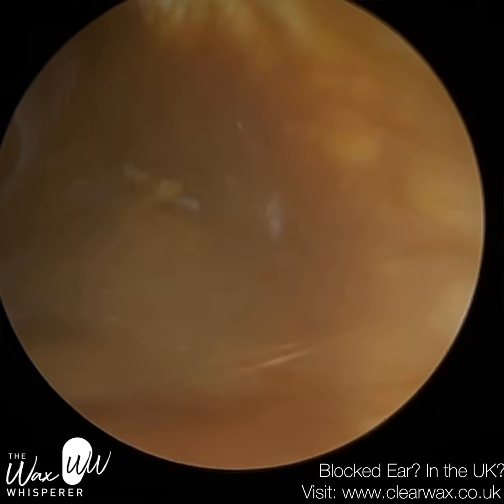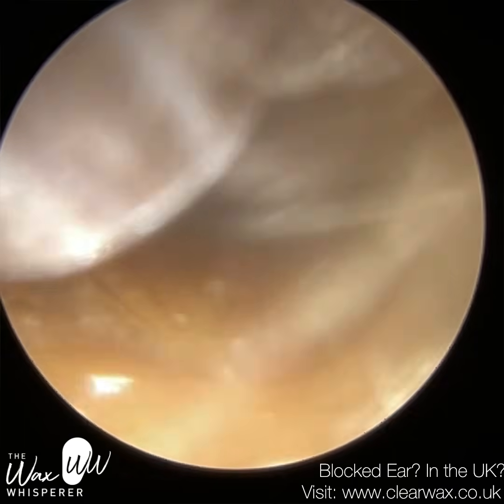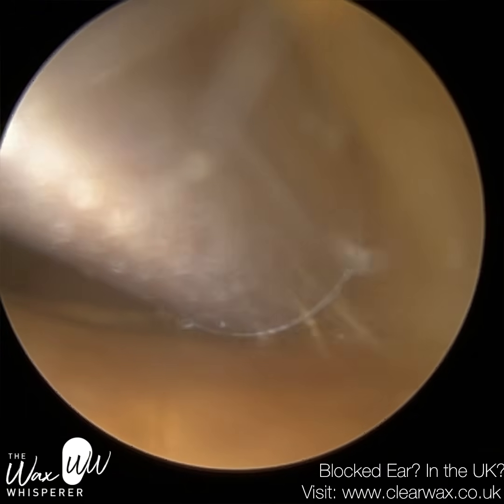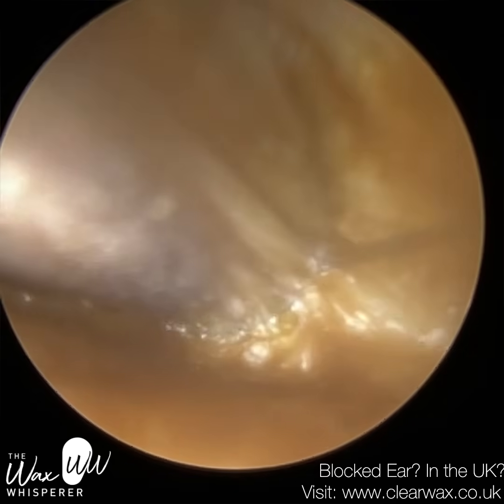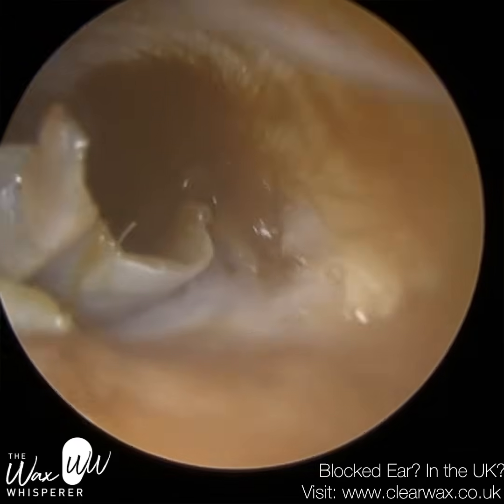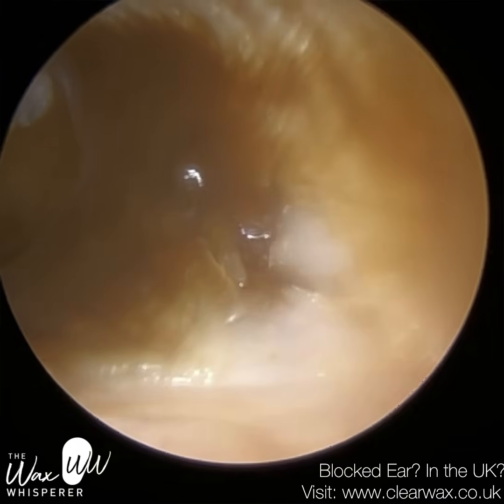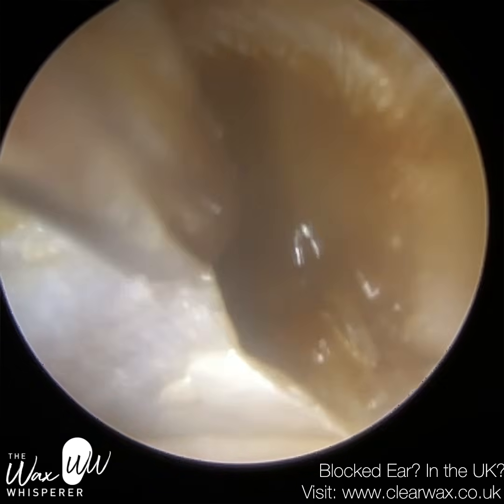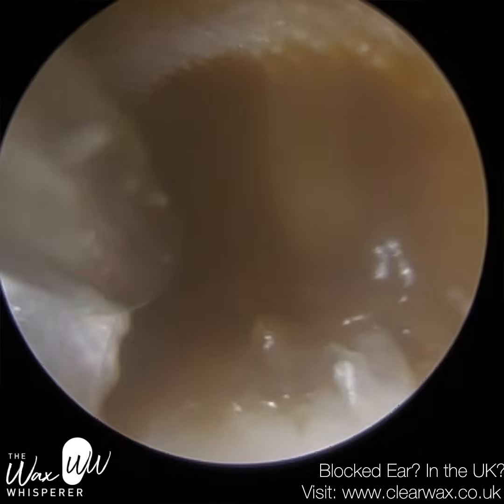We have here a patient who attended with a blocked left ear, and upon examination we can see that this patient is suffering from a condition called otitis externa. Otitis externa is an umbrella term given to an infection or inflammation of the outer ear. Now, more specifically, this patient has got eczema of the ear. They do also suffer from eczema of other parts of their body. And that's resulted in this patient developing excessive skin within the ear canal, which has failed to migrate.